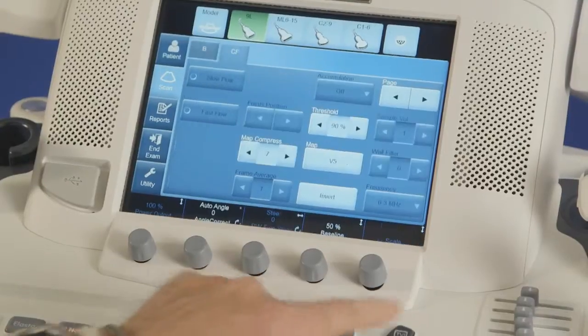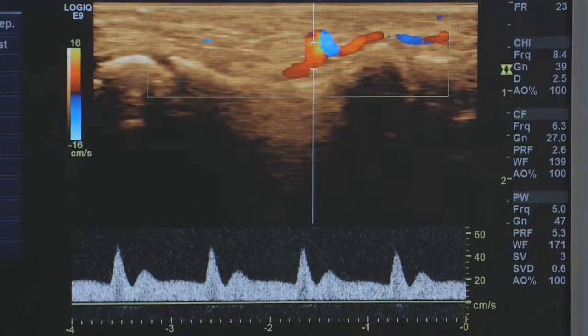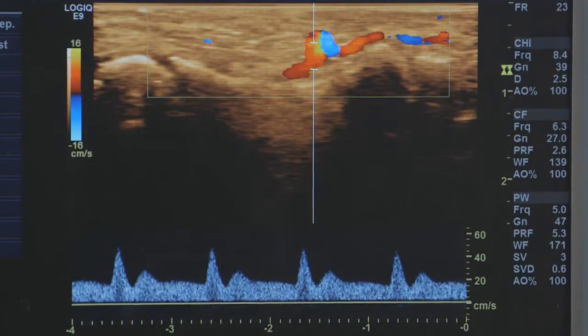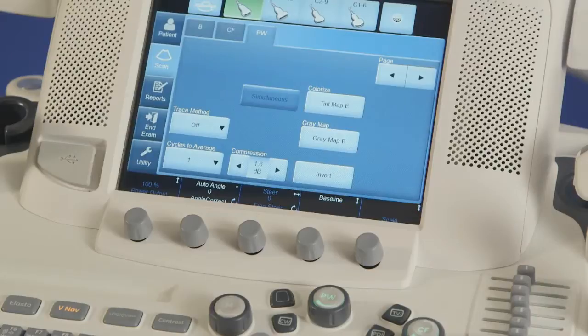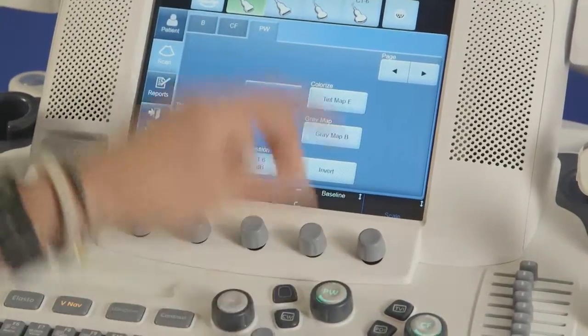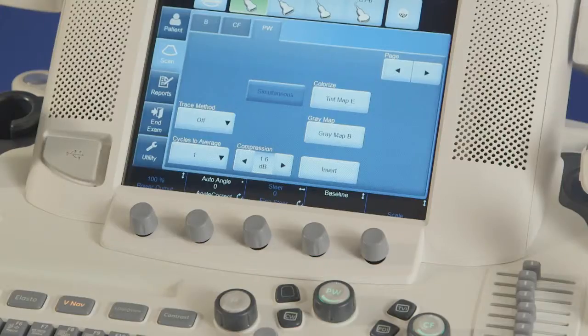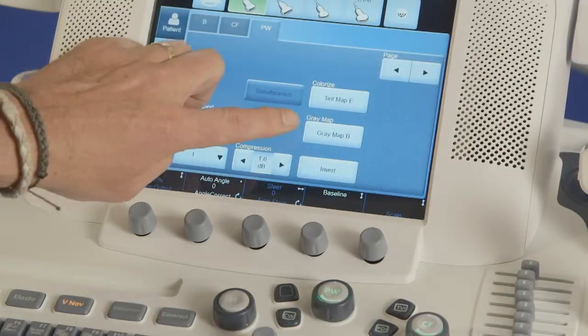Spectral colorize colorizes the spectrum as a function of power using the inverse of the color maps for the signal intensity in each Doppler line. Colorize enhances the visibility of the spectrum's characteristics and enhances your ability to identify spectral broadening and the edge contour of the spectrum used to define the peak frequency or velocity. To deselect the colorized map, simply select a new gray map.